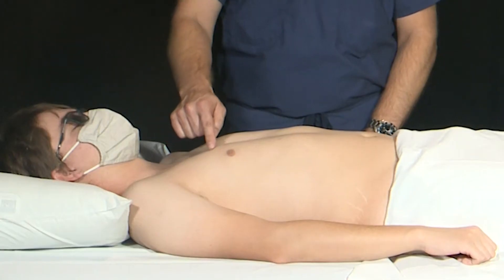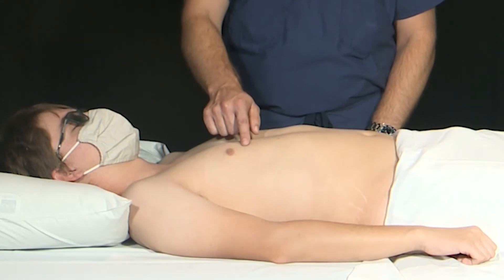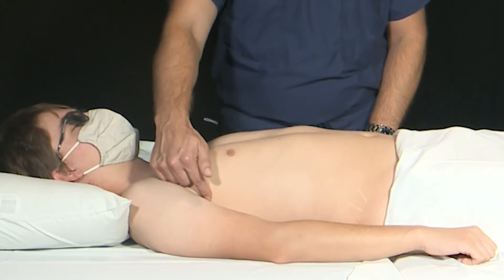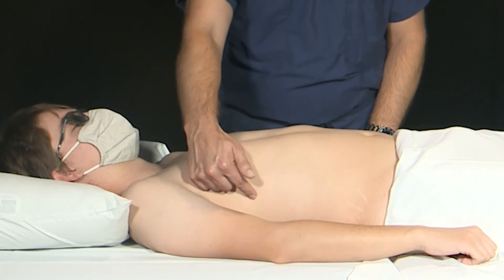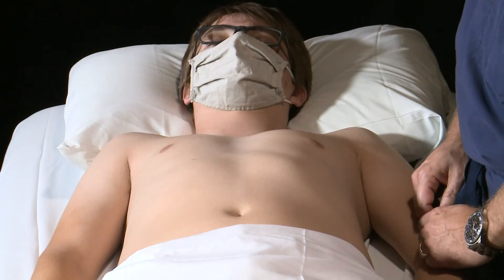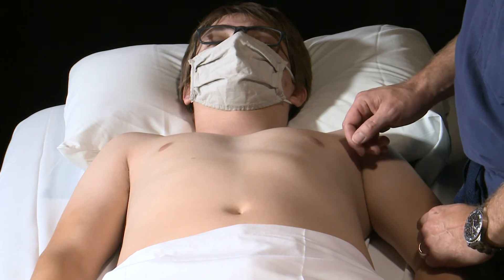Zone 1 will be the anterior superior zone. Zone 2 will be the anterior inferior zone. Zone 3 will be the lateral superior zone. And Zone 4 will be the lateral inferior zone. We will repeat that same protocol — those four different zones — on the left side of the chest.